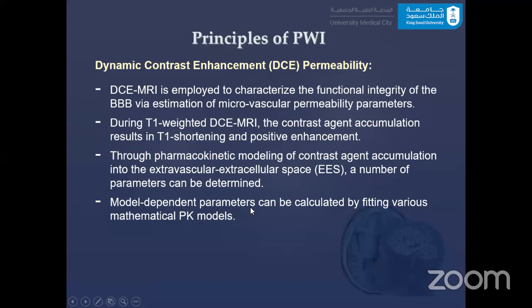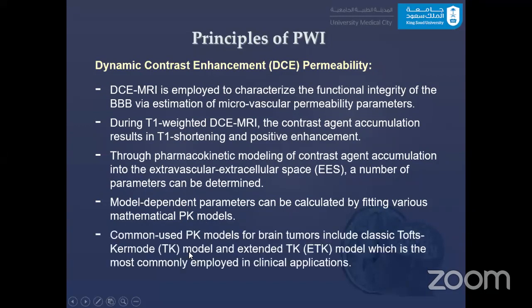It is model dependent. Parameters can be calculated by fitting various mathematical pharmacokinetic models. Commonly used models for brain tumors include the classical Toft model and the extended Toft model, which is the most commonly employed in clinical application.